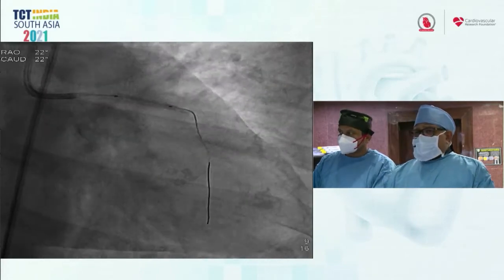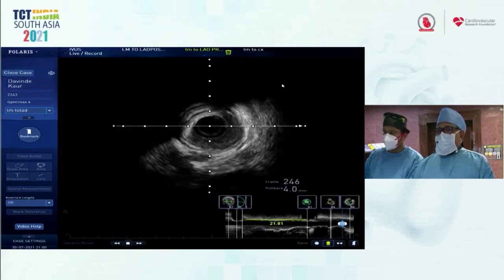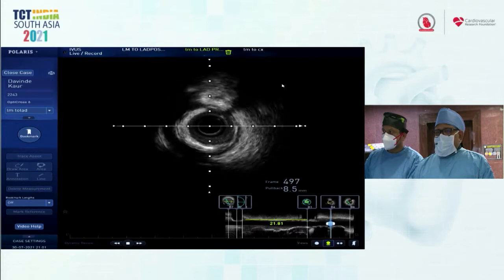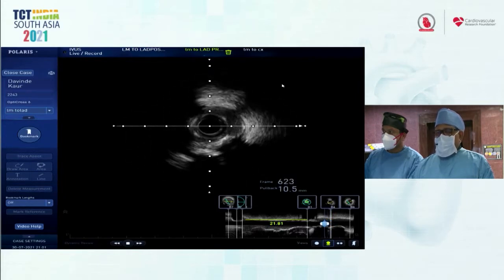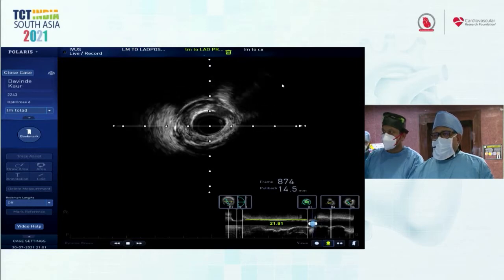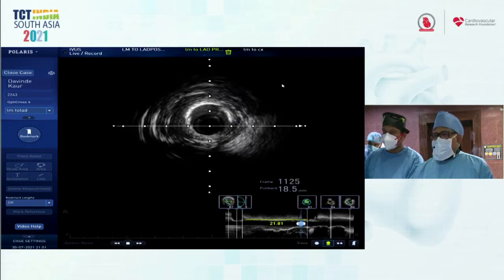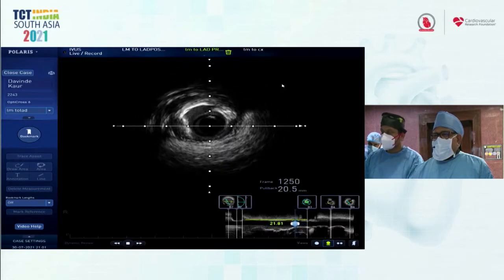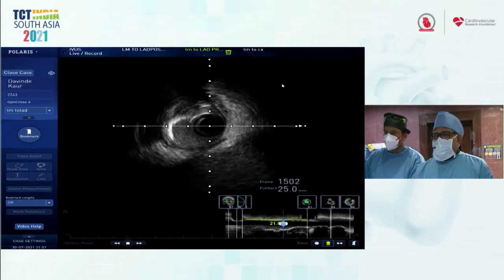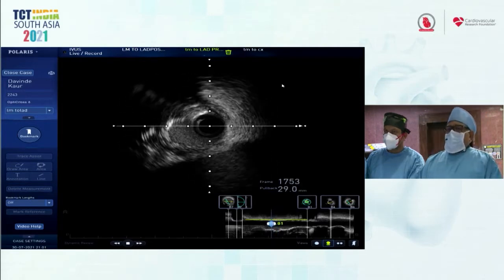Okay. So while you're going to run the IVUS, just one comment I'd like to make, getting Gary into it. Gary, we discussed the measurements of the circumflex, when we say that this is adequate and we don't need to involve the ostia of the circumflex into a stent, as 4 square millimeters. I actually have a philosophy around this: if we implant a stent, then the ostia of the circumflex has to be 5, ostia of the LAD has to be 6, polygon of confluence has to be more than 7, and left main has got to be more than 8, at least for the Asia Pacific region, and you can add on, but it's got to be that as minimum. And if we don't implant a stent, therefore de novo ostia need to be 1 square millimeter less, which means 4 for the circumflex, 5 for the LAD, to say we now don't need to implant a stent. Is that correct?